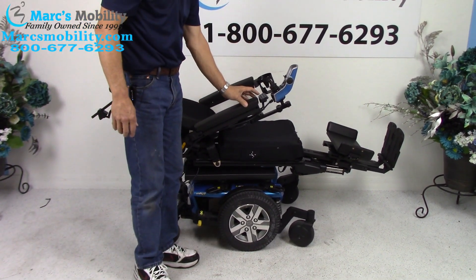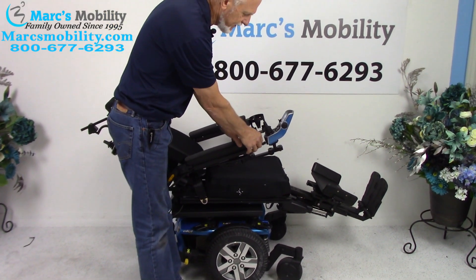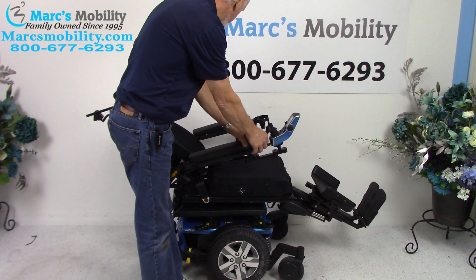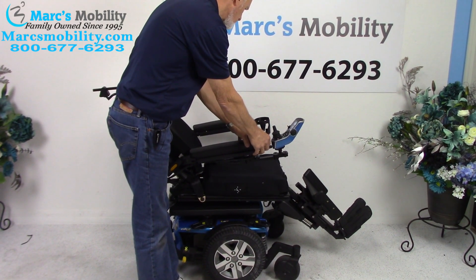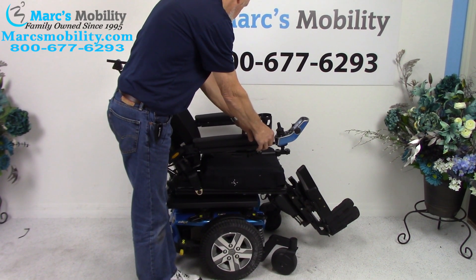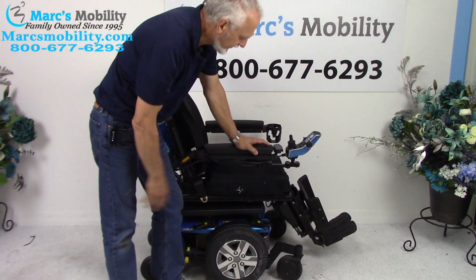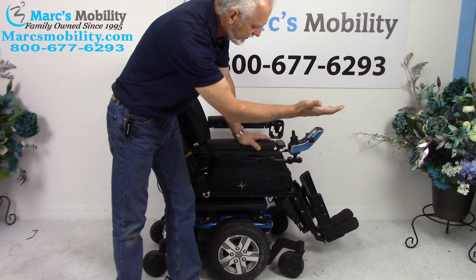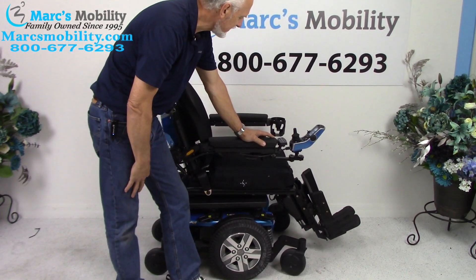I'm going to bring the recline back up, then bring the legs back down — doing two buttons at once to save time. If you're outside, make sure you leave your legs out a little bit so there's a gap. You don't want to be hitting a curb — keep some distance under their feet.